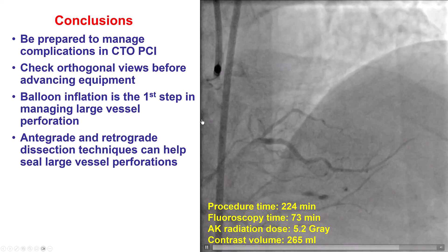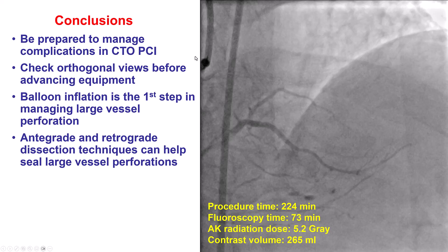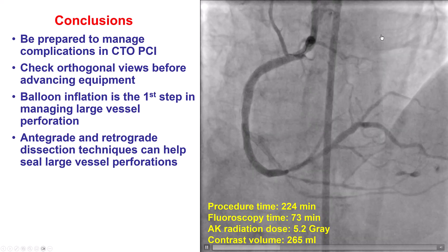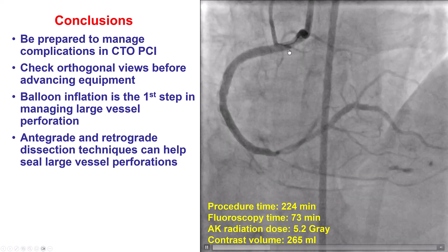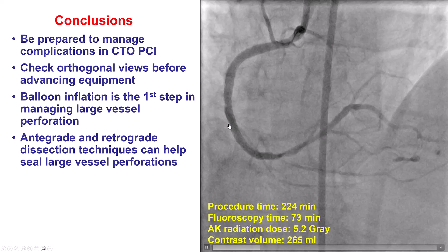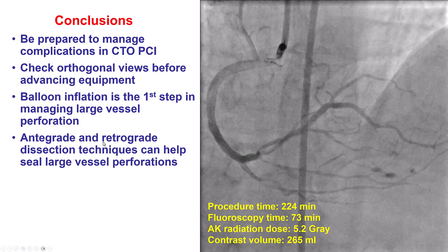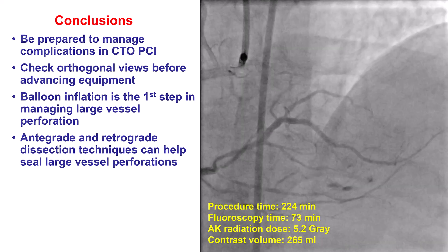When a complication such as perforation happens, the first step is to put a balloon up and in most cases stop the procedure. Here, however, stopping alone would not seal the perforation. So we tried an alternative approach: creating a dissection plane. While retrograde crossing failed, we initiated an antegrade dissection plane using the BASE technique with a knuckled wire, navigated around the area of perforation, reentered, and placed stents that helped seal the perforation. Having the ability to perform both antegrade and retrograde crossing techniques can help seal large vessel perforations using dissection reentry, with the dissection flap serving as a means to seal the perforation.